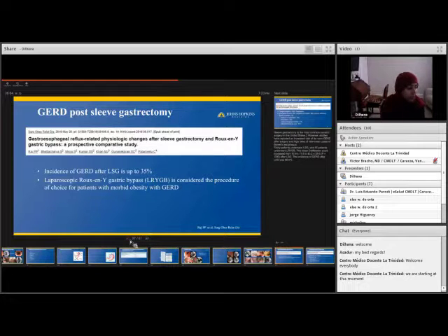And you have to either do enteral nutrition or you have to have a jejunal tube for feeding. And the patient most likely will have to stay in the hospital based on the situation so that they can have these frequent endoscopies. But there are a lot of studies where they've had good success managing these patients with endoscopic vacuum therapy.